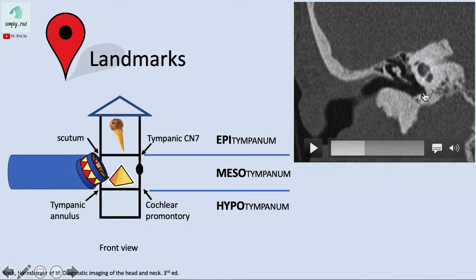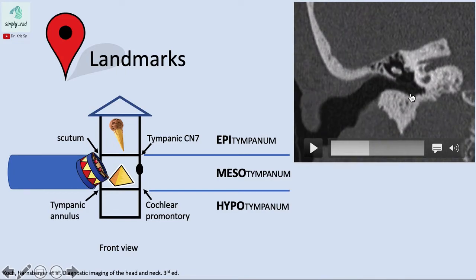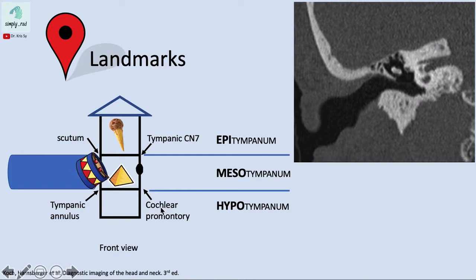On this cut you see the winding cochlea, similar to a snail with two eyes — the snail shell and two eyes representing the tympanic segment and labyrinthine segment. The tympanic segment is the medial margin of the epitympanum. Following the facial nerve, we identify the epitympanum. The tympanic annulus and cochlear promontory are visible: scrolling slightly, we can see the cochlear promontory. The inferior margin of the tympanic membrane attachment reveals the small depression called the hypotympanum. Between the epi and hypotympanum is the mesotympanum.